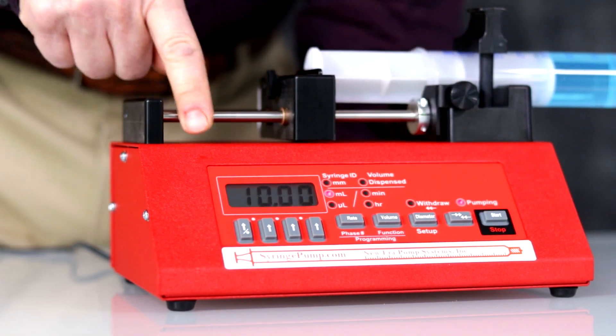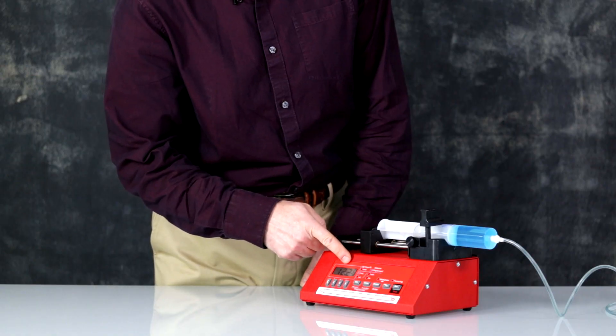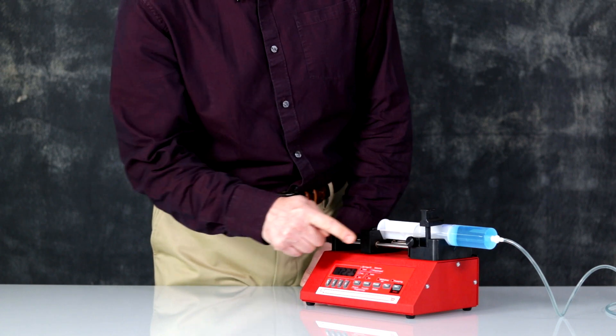Press start. When the set volume target is dispensed, the pump will stop pumping.